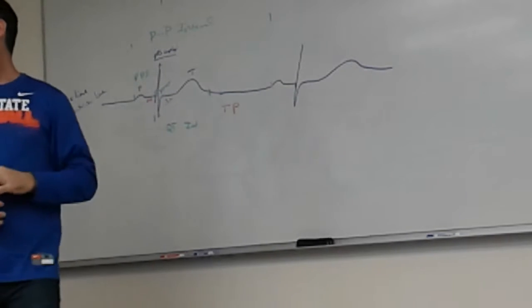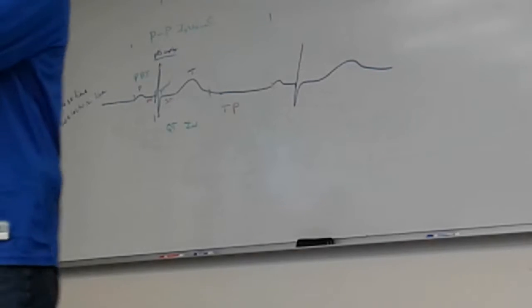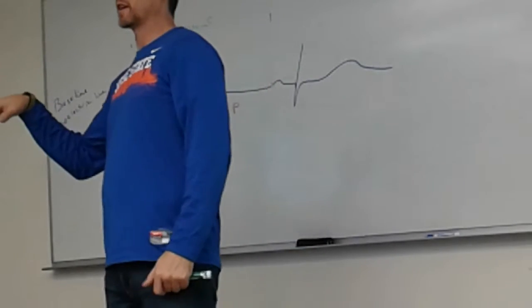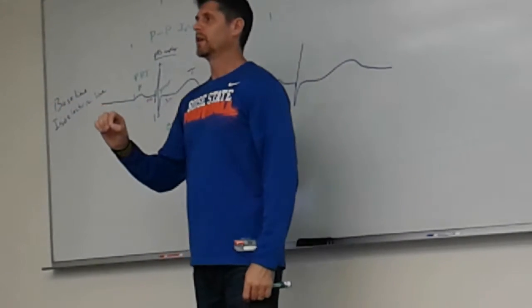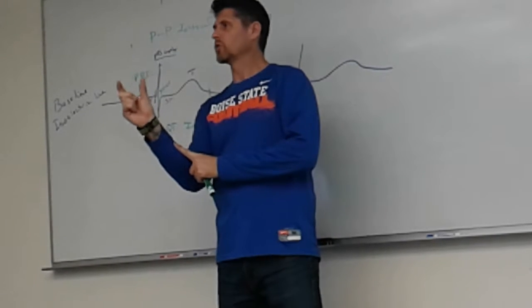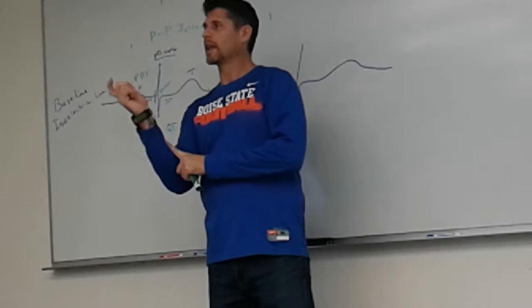So an interval is distance measured as time between at least two cardiac events? Nope, between at least a wave, to include a waveform and a segment. An interval is any period of time in the cardiac cycle that includes at least one wave and at least one segment.